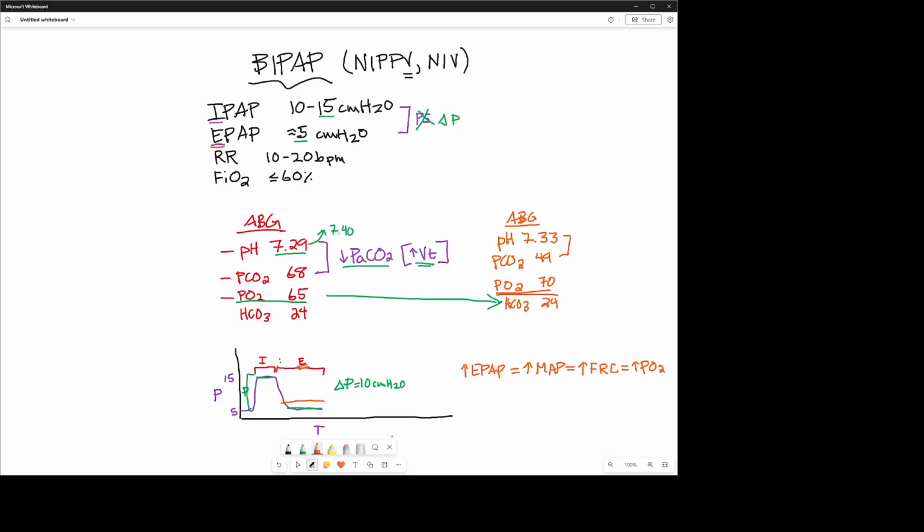Like, how does this affect the pressures in the lungs, and how is the mean airway pressure, where mean is average, affected more by PEEP and driving oxygenation? Well, you're affecting the pressures in the lung for more of the respiratory cycle. The exhalation phase happens for twice as long as the inspiratory phase. It's a good way to keep that straight and remember that.